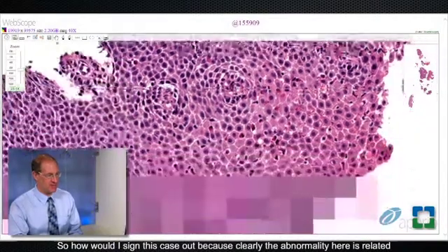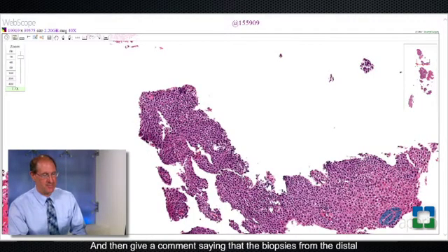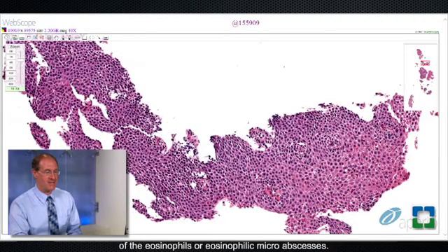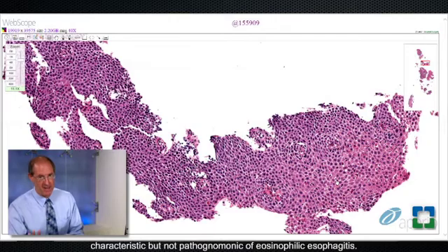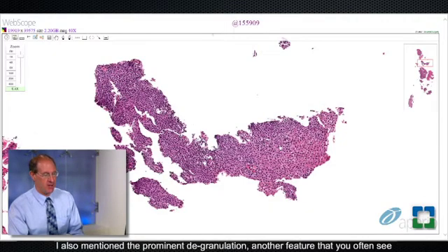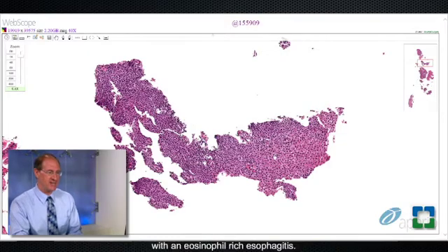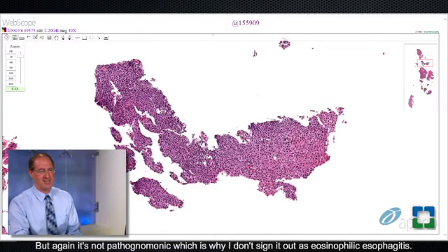So how would I sign this case out? Clearly the abnormality here is related to the eosinophilia. I would simply call this an eosinophil-rich esophagitis and then give a comment stating that the biopsies from the distal esophagus show prominent intraepithelial eosinophils — given approximate count, which in this case is greater than 50 eosinophils per high-power field. I tend to mention whether I see prominent surface layering of the eosinophils or eosinophilic micro-abscesses, as those are histologic features characteristic but not pathognomonic of eosinophilic esophagitis. I also mention the prominent degranulation. I don't sign it out as eosinophilic esophagitis, because it's not pathognomonic.